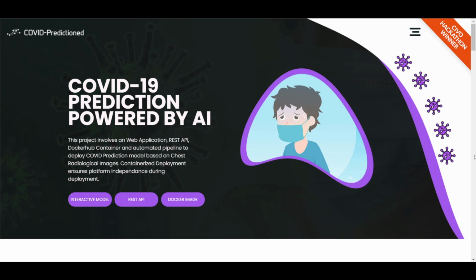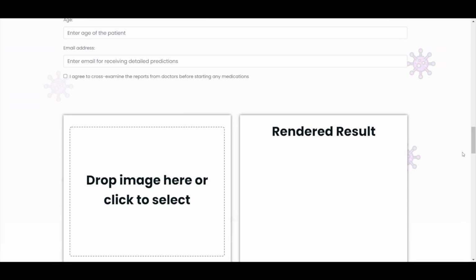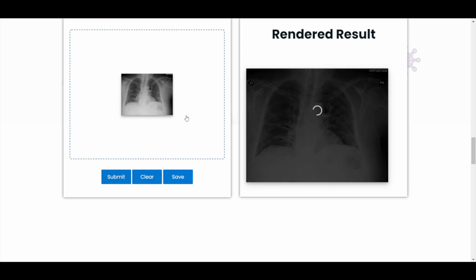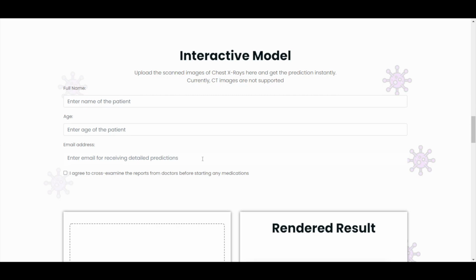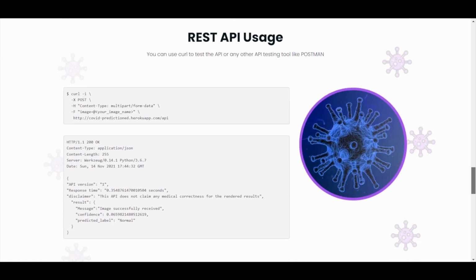In this hackathon, I developed a computer-aided diagnosis system which is used to predict whether a person has been infected with COVID-19. The prediction is possible through the integration of the COVID-19 X-ray classifier into a web application. By uploading front chest X-rays, the model can perform classification between COVID and non-COVID X-rays using the modified DenseNet architectures. Users are given the option to save the results to the database to receive further advice from doctors. The data is stored securely in MongoDB.